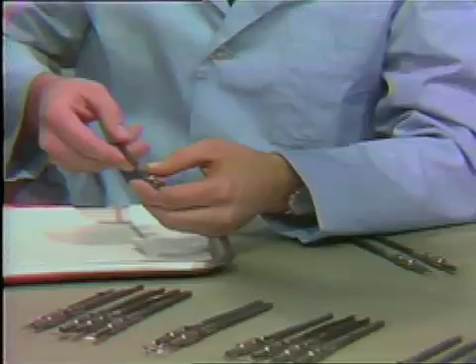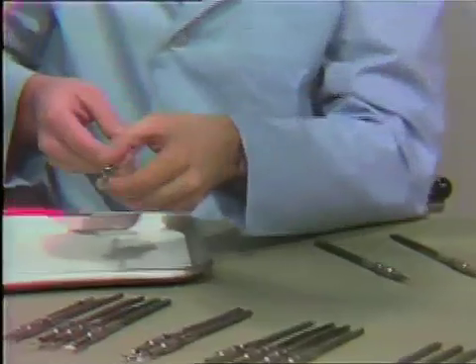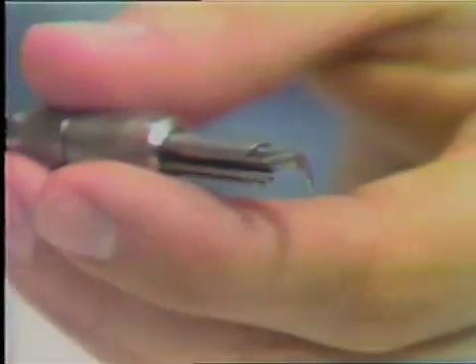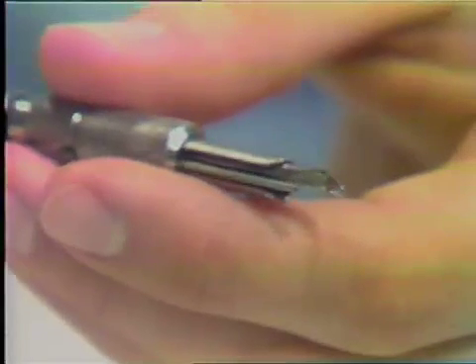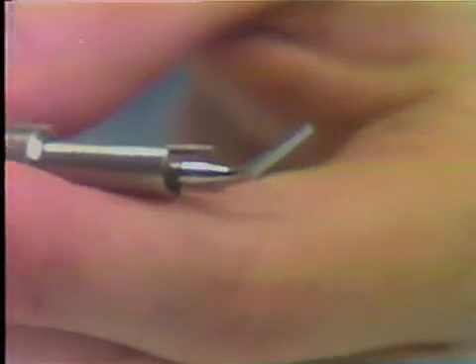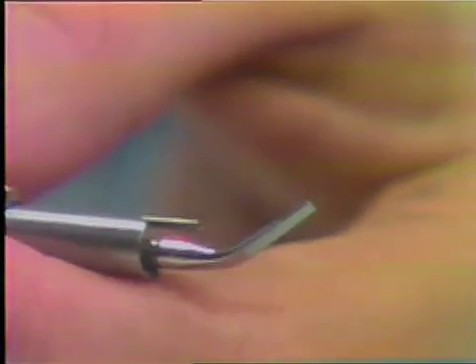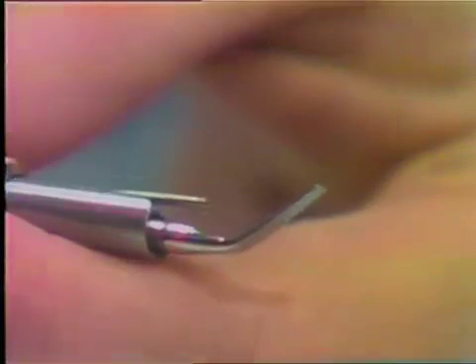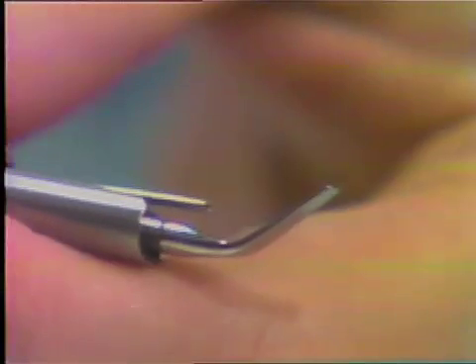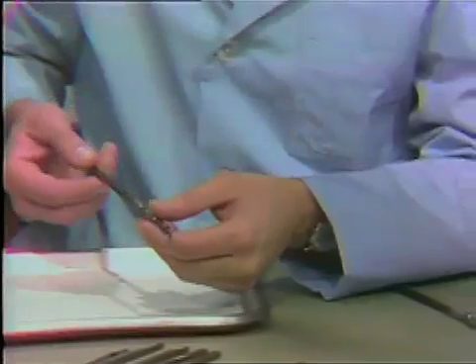In addition to the P1, there is another tip with essentially the same design, only a little bit larger. This tip, called the P3, is used mainly for supragingival calculus removal from the labial and lingual aspects of the teeth. It is also used for heavy black tar or stain in heavy smokers. The action of this tip uses an erasing motion — the tip of the instrument is used to scale rather than the sides.